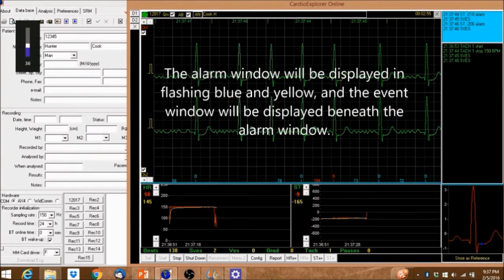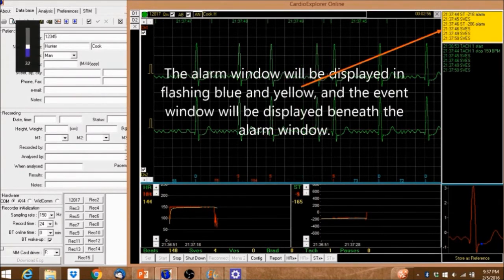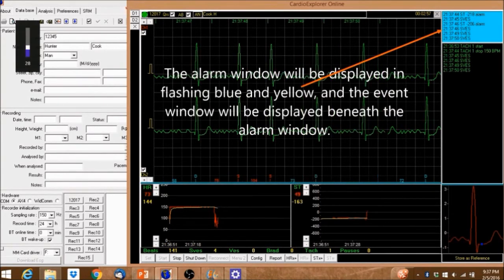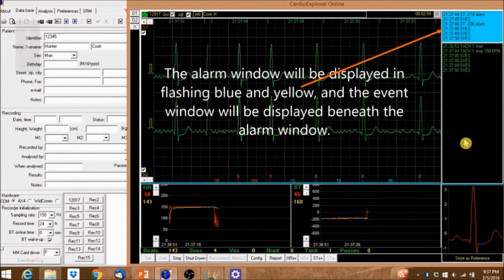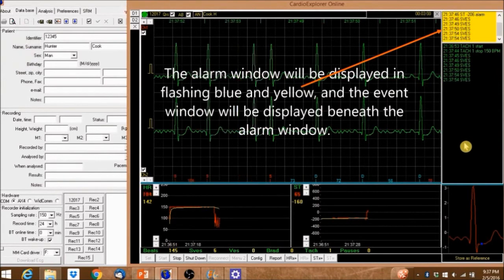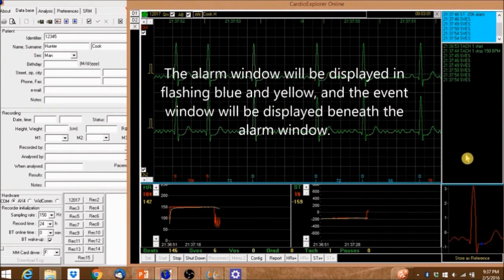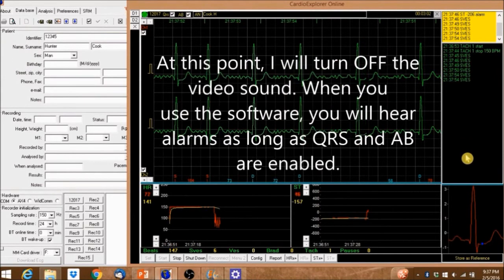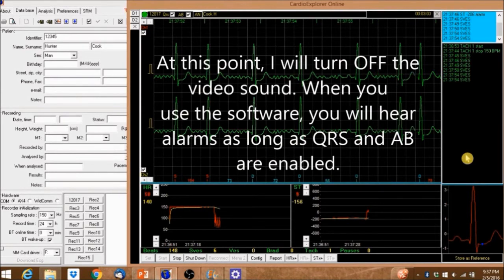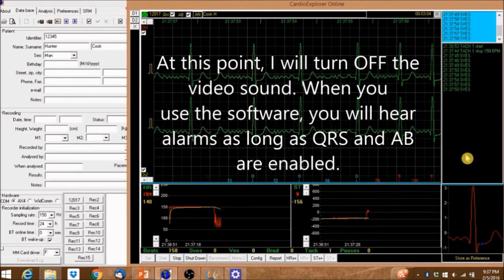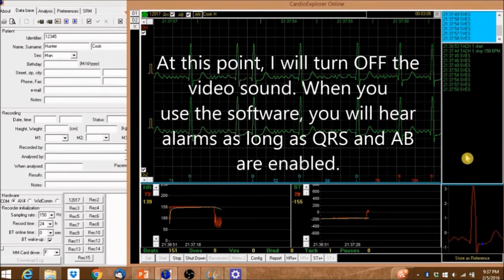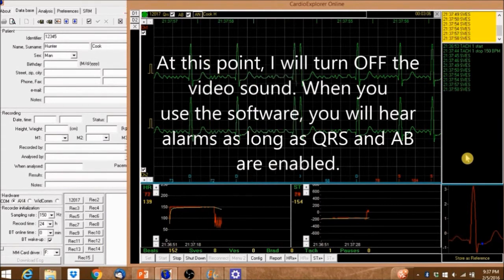The alarm window will be displayed in flashing blue and yellow, and the event window will be displayed beneath the alarm window. At this point, I will turn off the video sound. When you use the software, you'll hear alarms as long as QRS and AB are enabled.